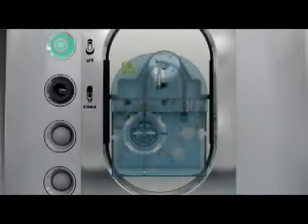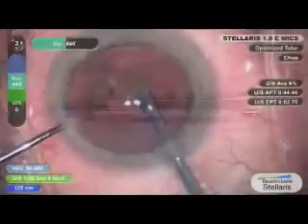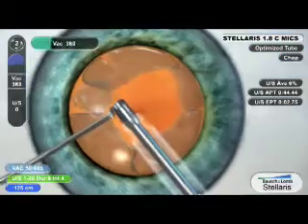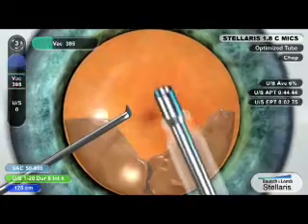The proprietary software design of the Stellaris Advanced Flow Module delivers both flow and vacuum phaco performance with a single aspiration system. Stellaris EQ Equalizing Fluidics manages the balance of fluid inflow and outflow by constantly monitoring changes in vacuum and instantaneously adjusting aspiration to avoid post-occlusion surge and preserve chamber stability throughout the procedure.